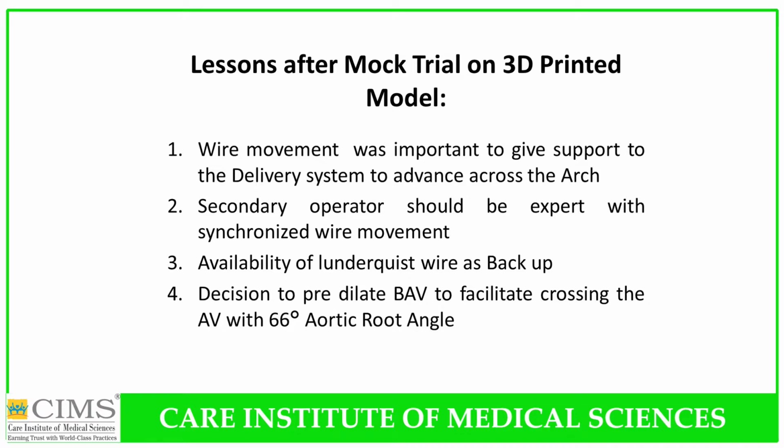So lessons after mock trial on the 3D printed model: wire movement was important to give support to the delivery system. Secondary operator should be expert with synchronized wire movement, and we decided to keep the Lunderquist wire as a backup in case the Confida did not work well. Decision to pre-dilate with balloon aortic valvuloplasty was made to facilitate the crossing of the aortic valve with the 66-degree aortic root angle.